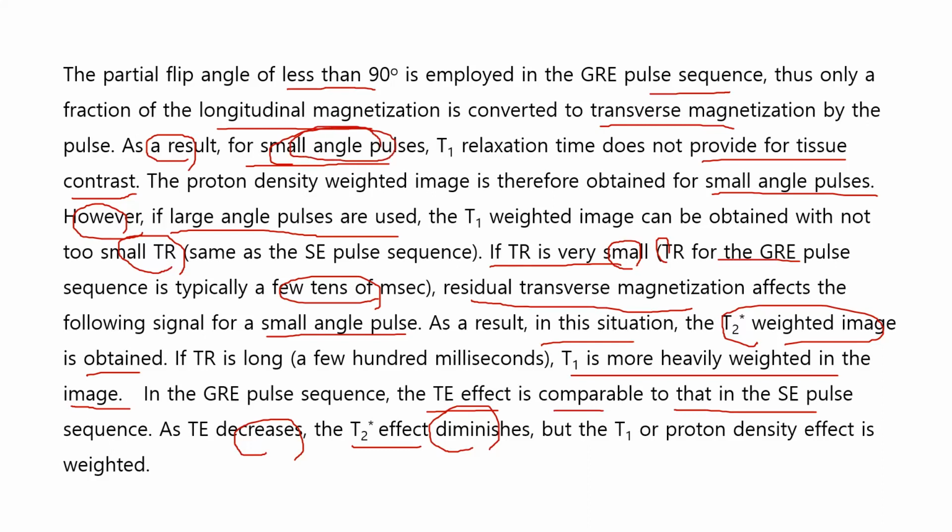Then we can have the proton density weighted image, and if you use a not too small TR, then we can get the T1 weighted image.